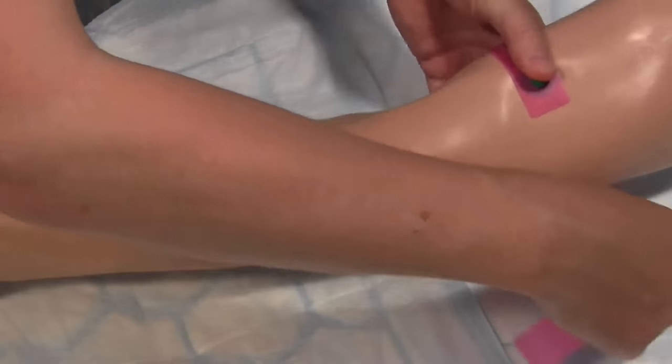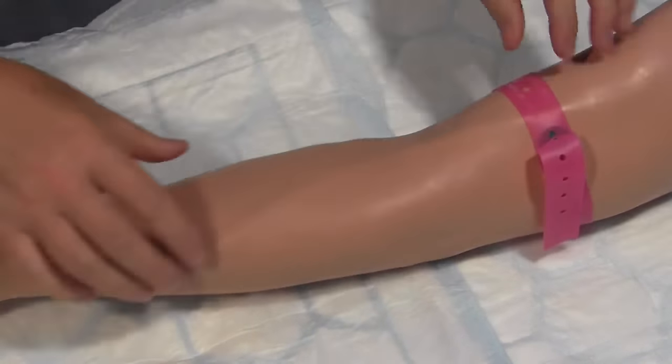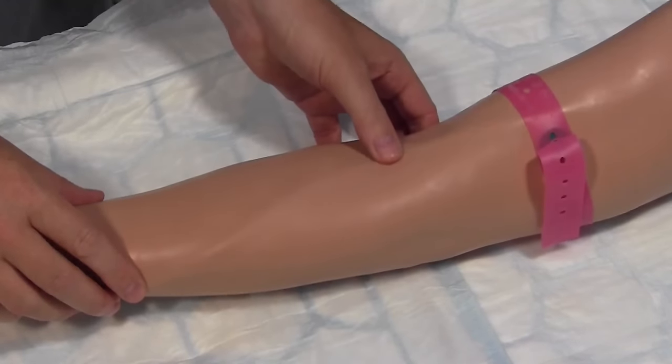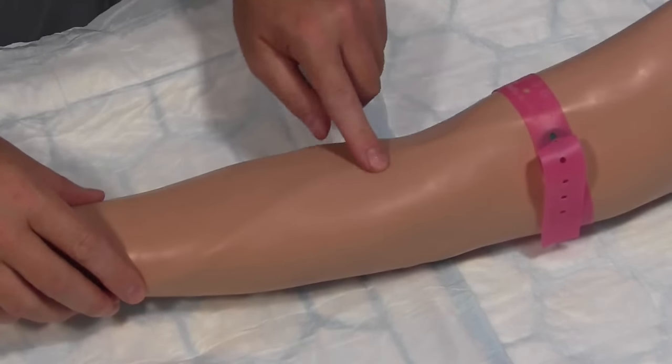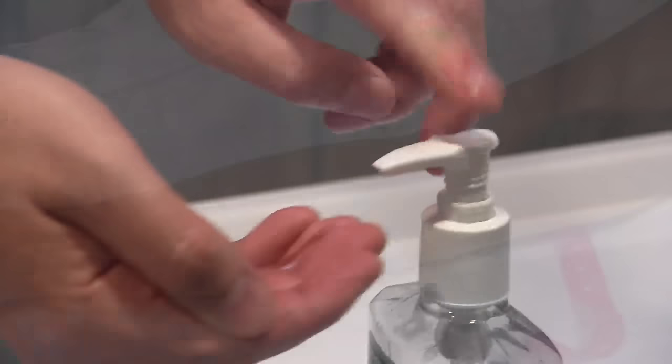Apply the tourniquet about a hand's breadth above the proposed puncture site. Select a nice visible bouncy vein. Release the tourniquet for the patient's comfort and to prevent damage to the blood cells.